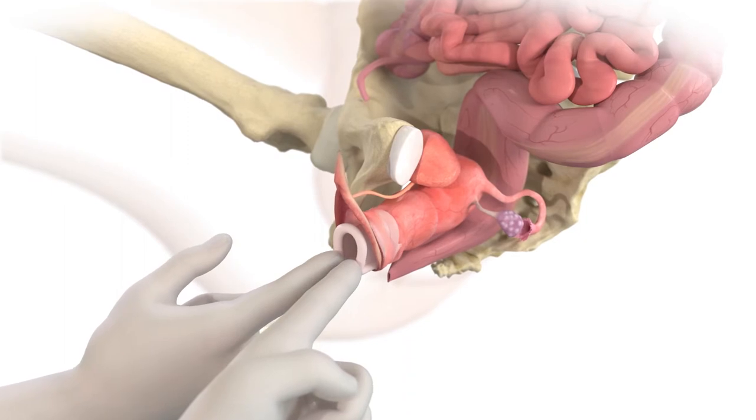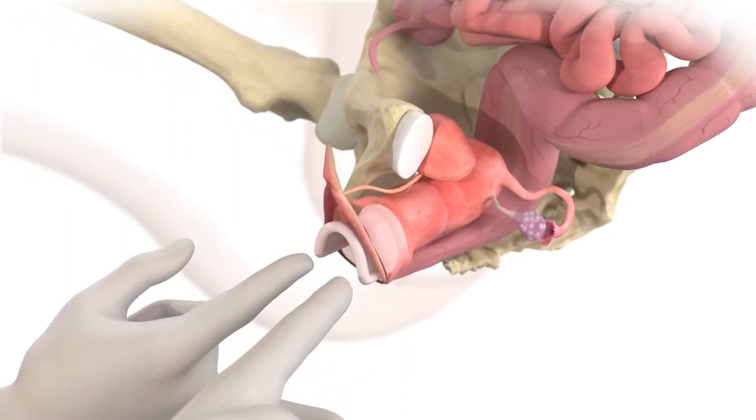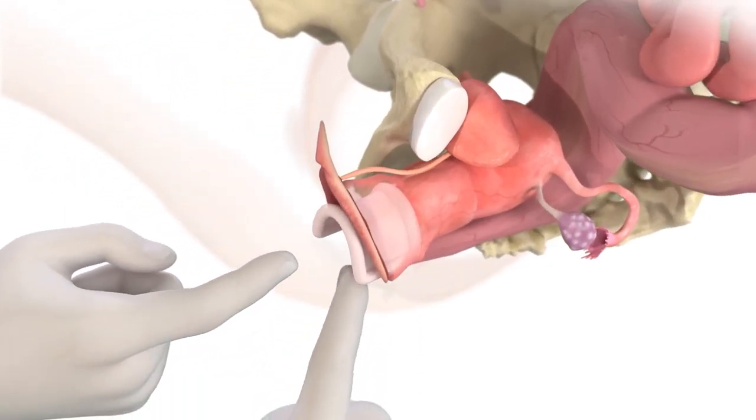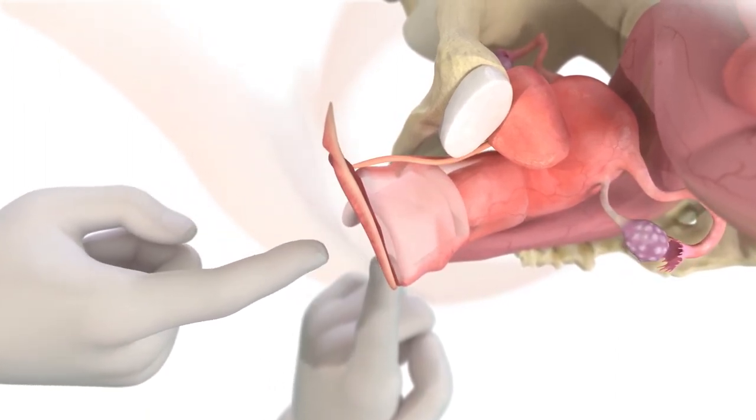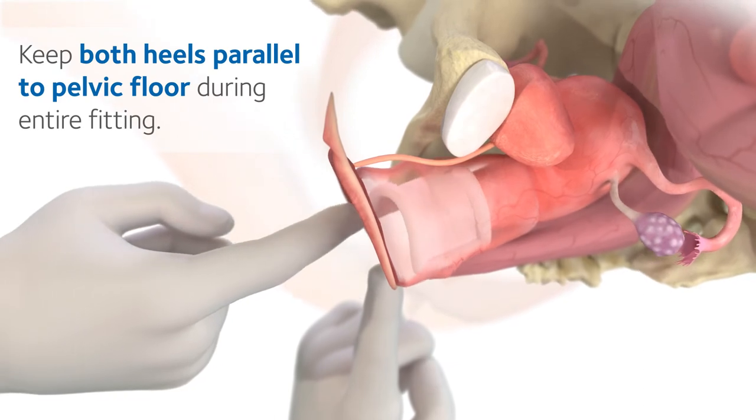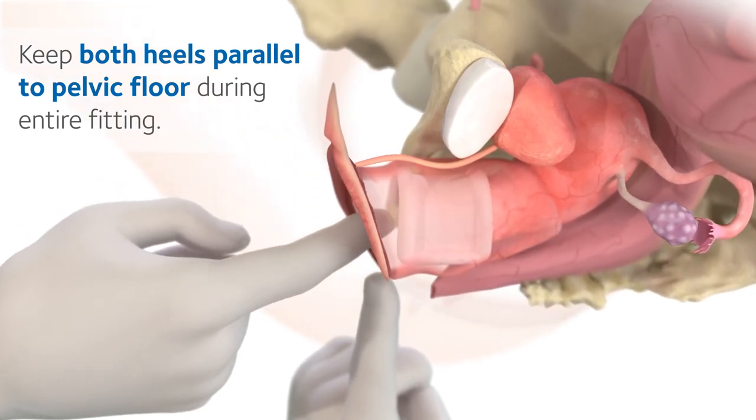Push the pessary past the introitus and expand the pessary using two fingers. Gradually push the right heel back, keeping the left heel forward. Keep both heels parallel to the pelvic floor during the entire fitting.